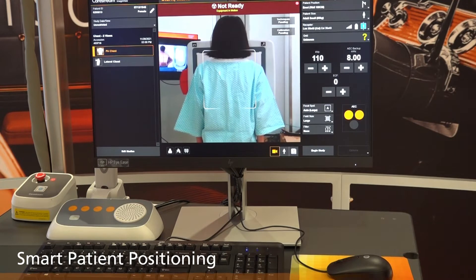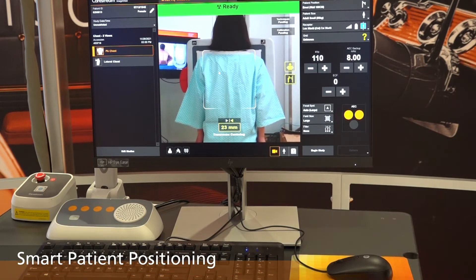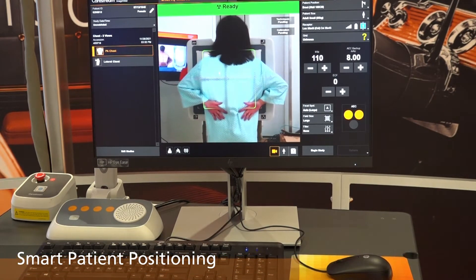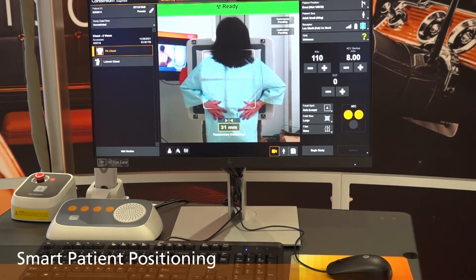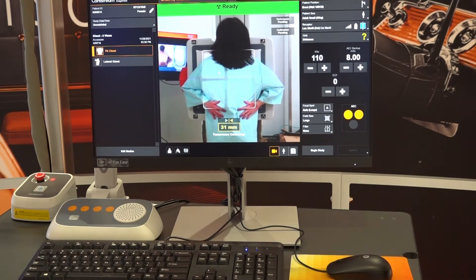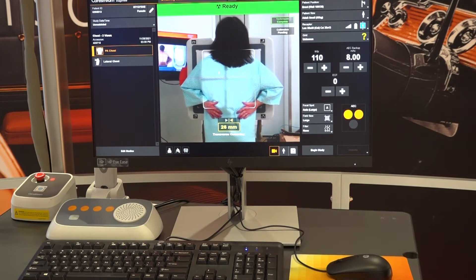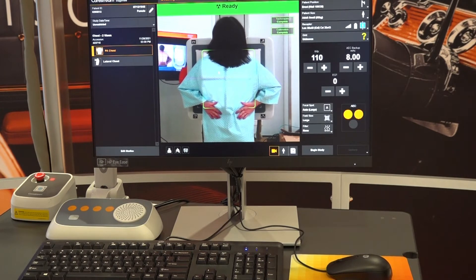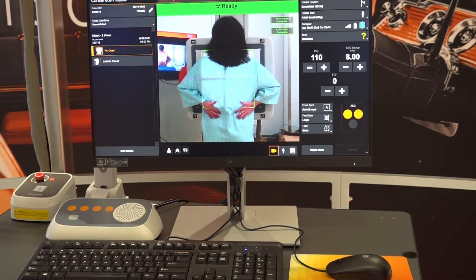Smart patient positioning augments this live view with overlays indicating the boundary of the detector and, more importantly, feedback on the patient's pose and position along with suggested corrections. For example, if the patient is not centered, the correction needed is indicated. This allows the radiographer to use this information to correct the patient positioning prior to taking the exposure and help reduce the need for repeats.